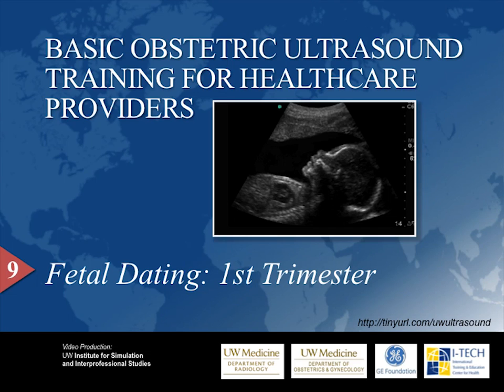My name is Dr. Christina Adams-Waldorf, and I will be narrating this 9th video in our pregnancy ultrasound series. This video will teach how to determine the age of a fetus in the first trimester. Please visit our website for access to all of our video and training materials.